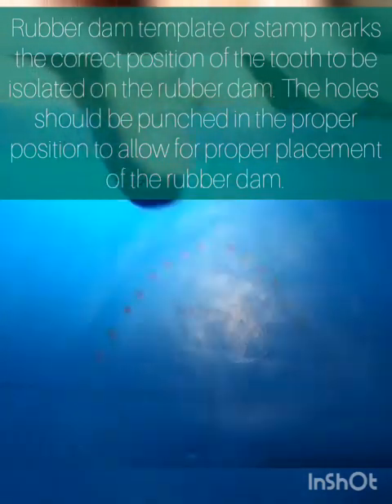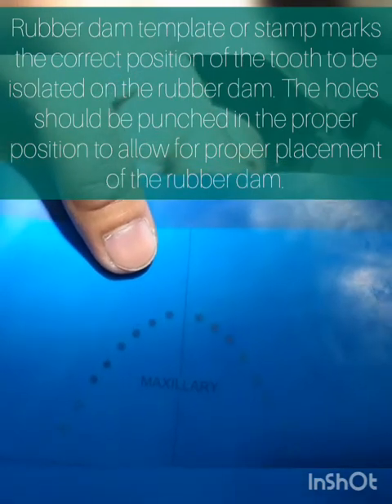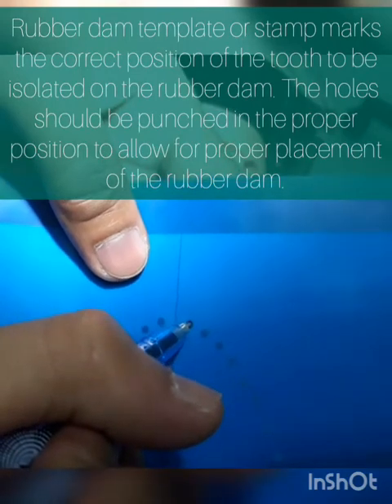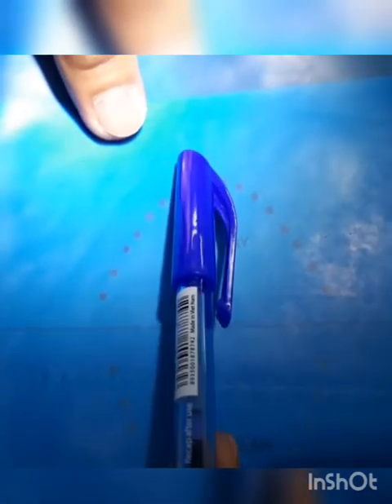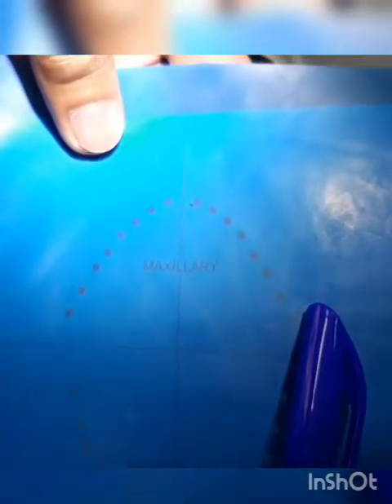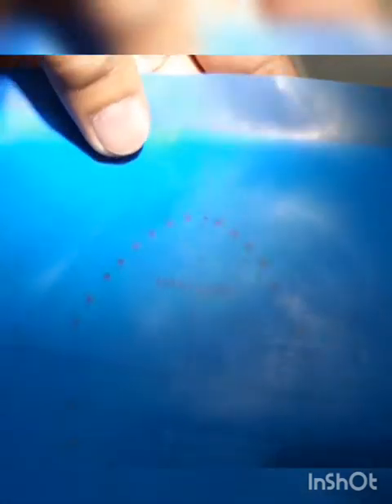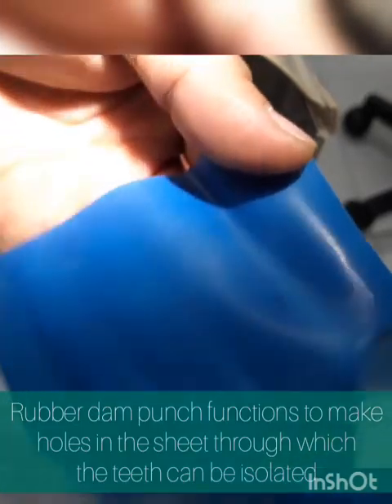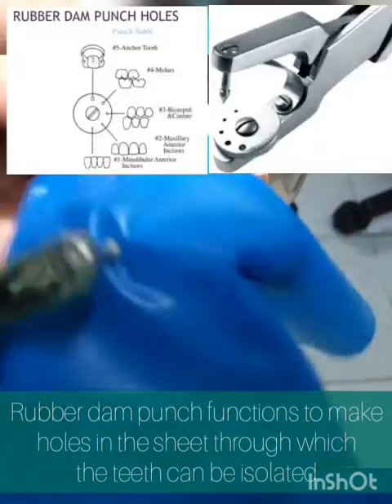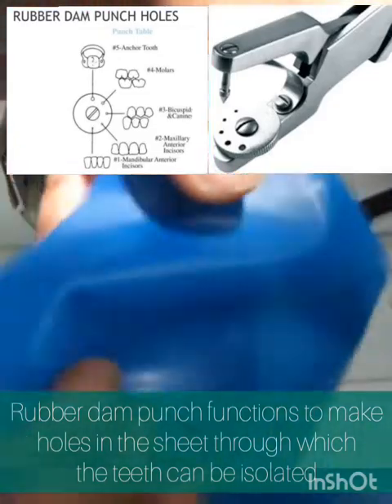Next is to make perforation or a hole on your rubber dam sheet. Using our template, place the rubber dam sheet on top of the template. We are doing rubber dam isolation on tooth 21, so we make markings on this. Your markings depend on which tooth is involved — upper right quadrant, upper left quadrant, lower left, and lower right quadrant. After creating markings on our rubber dam sheet, using our rubber dam punch, we make a hole by following the marking. Make sure that you have properly punched your rubber dam sheet.